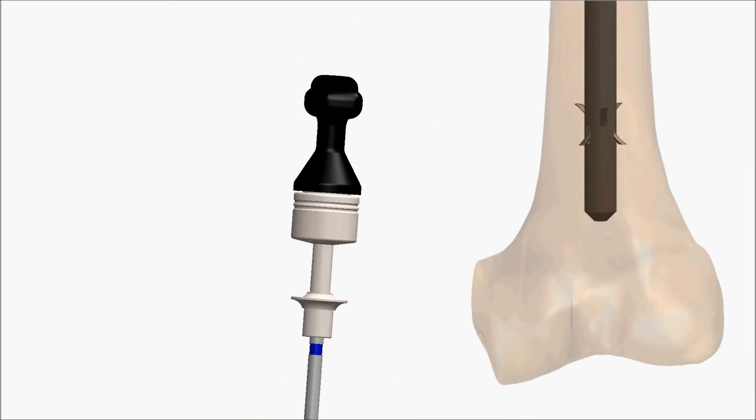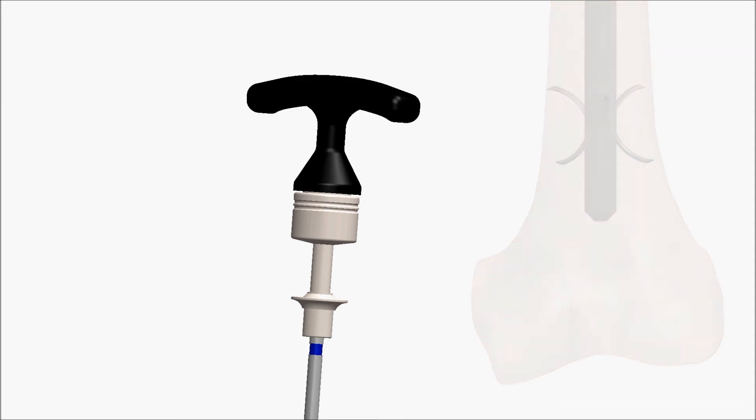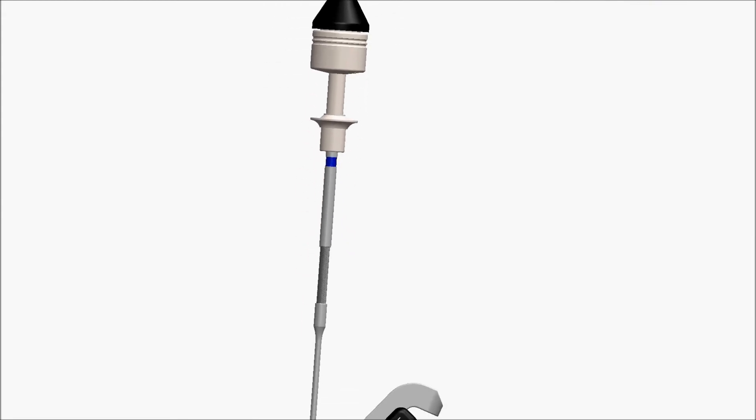Turn the T-handle clockwise to deploy the nail talons. The extent of talon deployment is at the discretion of the surgeon. Please see the technique guide for more details. Talon deployment should never be done using a powered instrument.